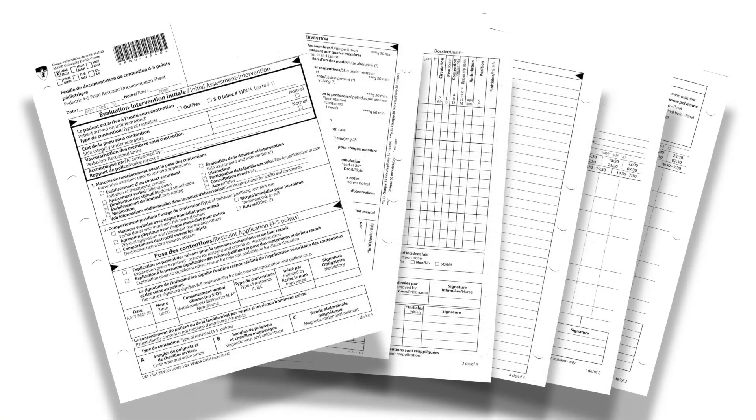Your patient is now immobilized with pinel restraints. For monitoring, please refer to the surveillance sheet available on your unit.